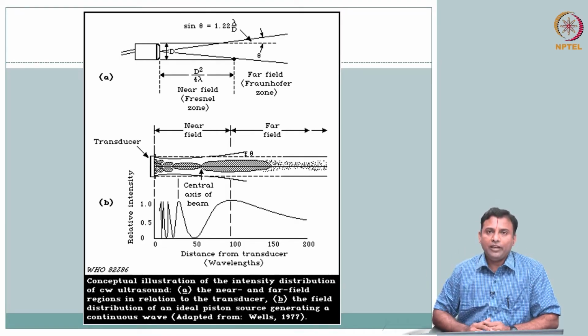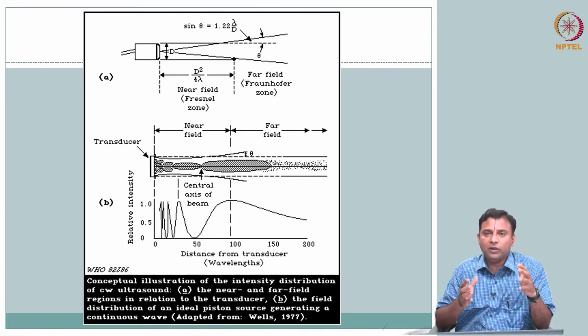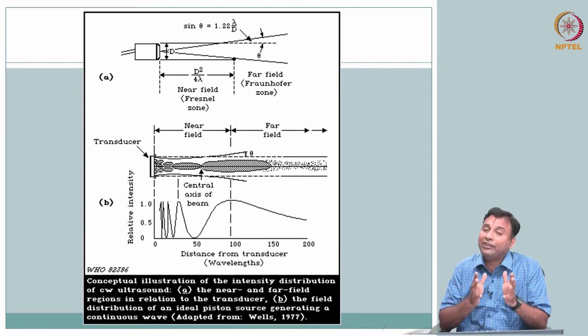So, the style that we have adopted is, we did instrumentation and then we go into imaging, the imaging equation or the image formation. But I told you I have slightly switched the style here, because the last part of the imaging equation that we typically cover in physics, I did not cover. I said we will start with the instrumentation and then bring in those equations.